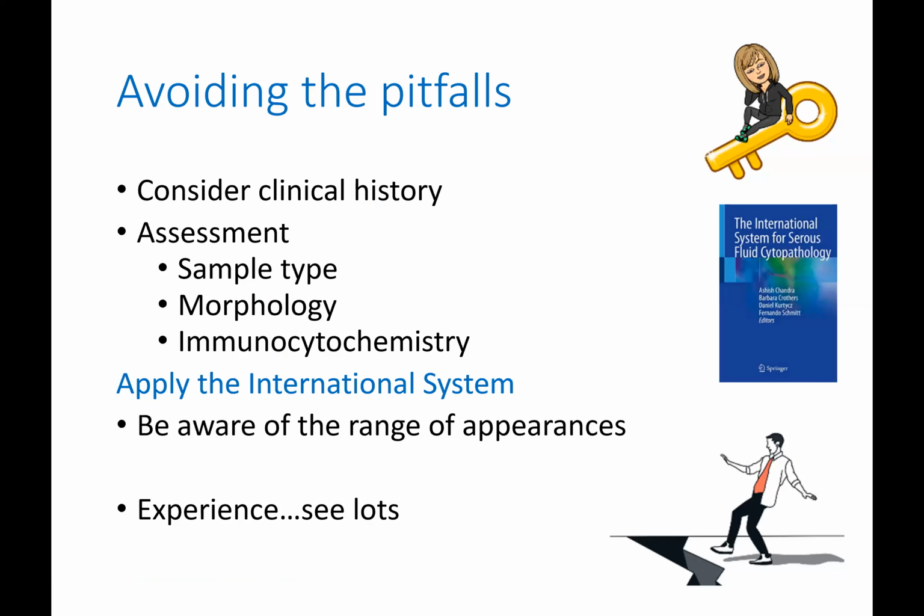In summary, avoiding the pitfalls in serous fluid cytology involves taking into account the clinical history. When making assessment of the fluid, we need to recognise the sample type, as well as paying attention closely to the morphology, both architecturally and cytologically, often alongside the immunocytochemistry. I think that applying the information in the international system, as with the Paris system, can be very helpful in reaching the correct and specific diagnosis.